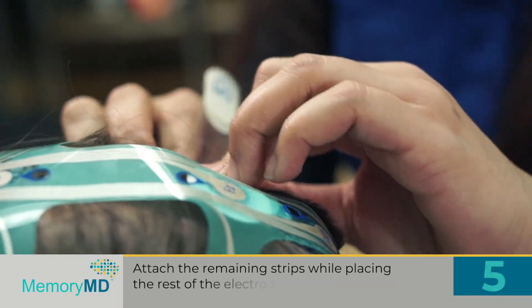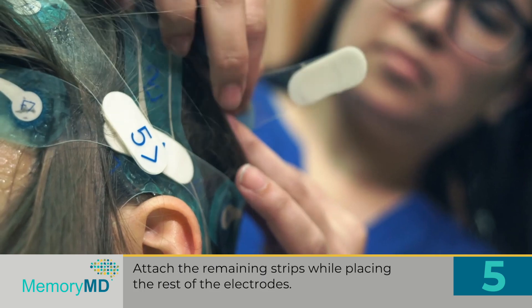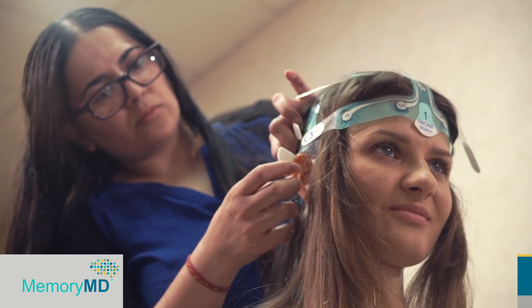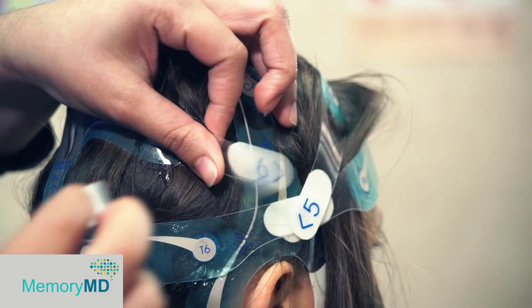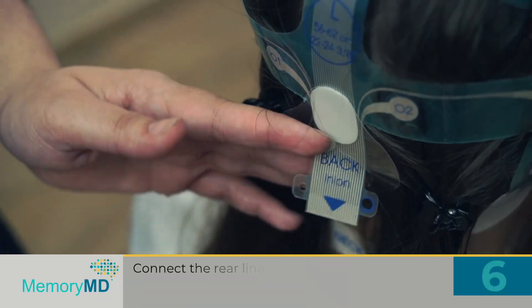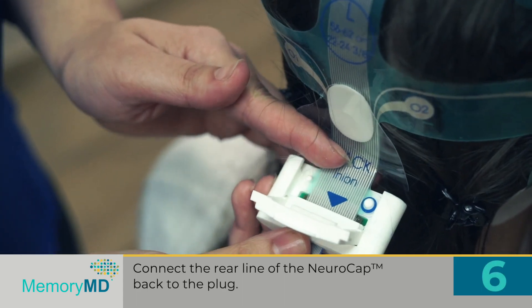Step 5: Attach the remaining strips while placing the rest of the electrodes. Step 6: Connect the rear line of the NeuroCap back to the plug.